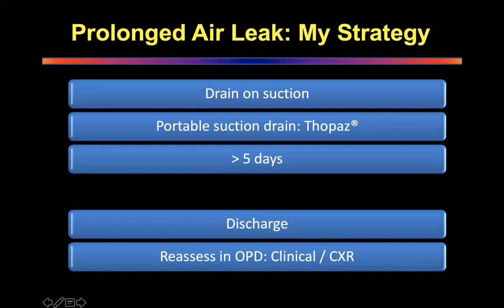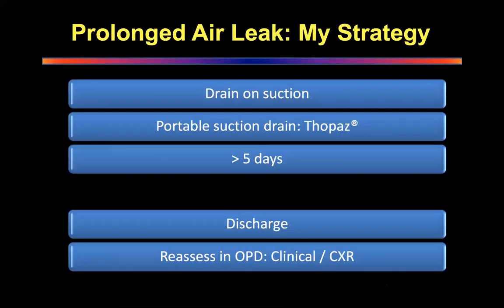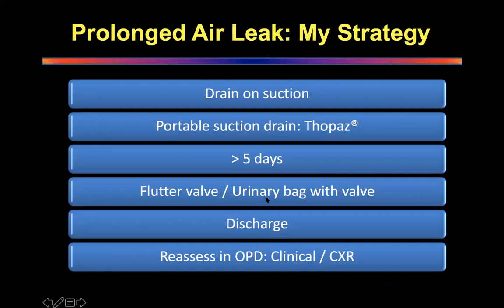The other thing that I also do with this patient is I will put in a little bandage, a long roller bandage, and tie this bag across his shoulder so that it becomes like a purse. So he can carry it in his purse below his shirt, and then he can wear his shirt on top of it. So I will very quickly connect him to the flutter bag.